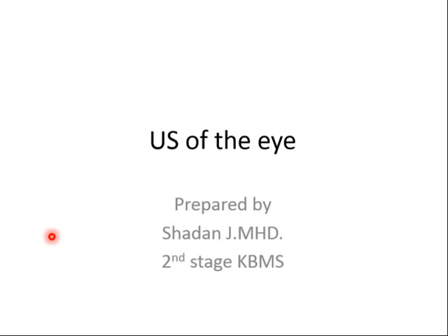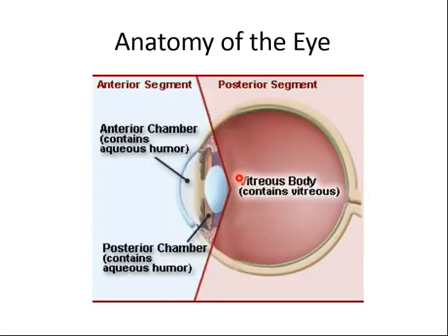Good morning, everyone. Today I will discuss the ultrasound of the eye. I will try to discuss it briefly. It's a simple procedure and it's easy to understand. First, I would like to start with a brief explanation of the anatomy of the eye.